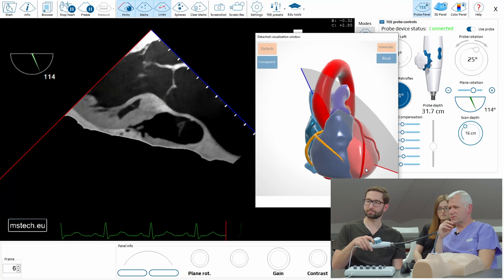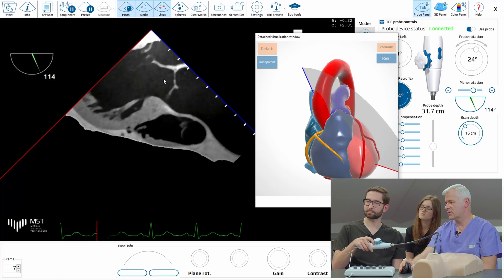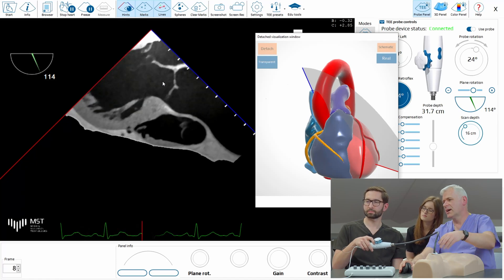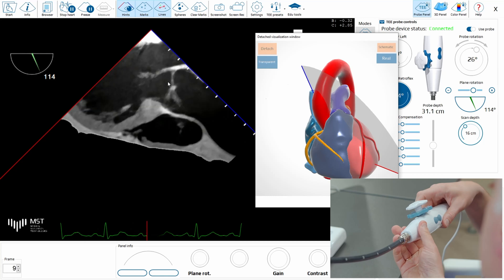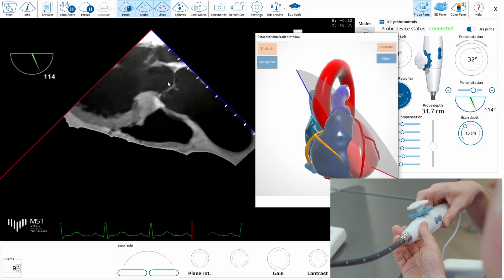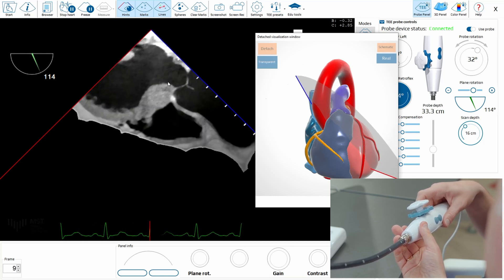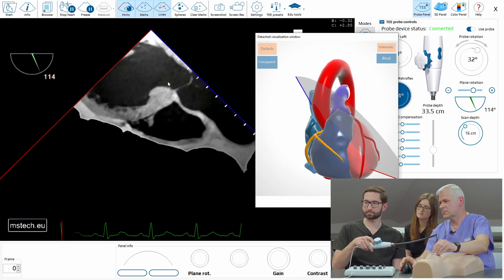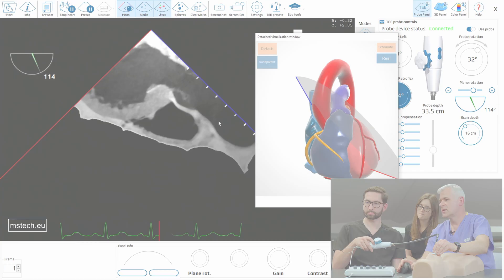An advantage of this view is that you can put a spectral Doppler here and check, let's say, the velocity in the LVOT or in the aortic valve. I'm just putting it very close to the edge of the sector because now it's more aligned with the flow — it will be exactly at the line of the Doppler measurements.